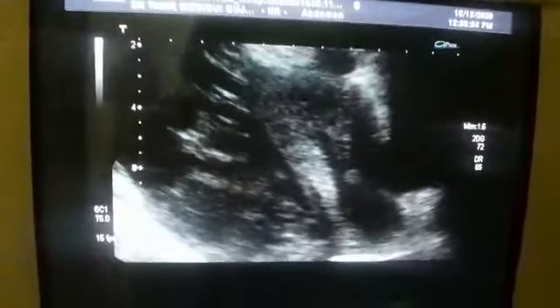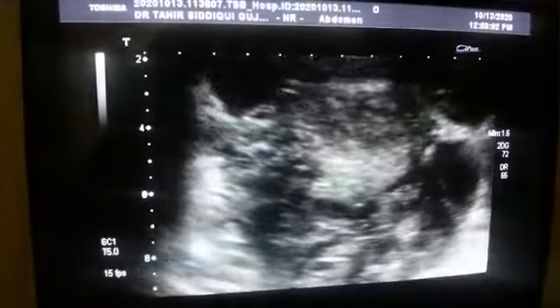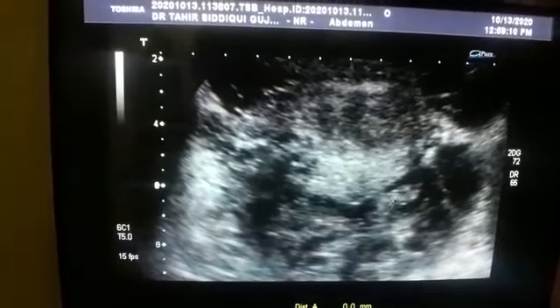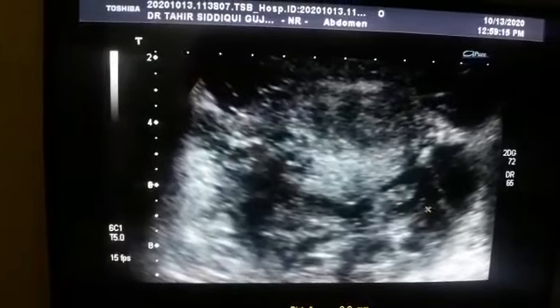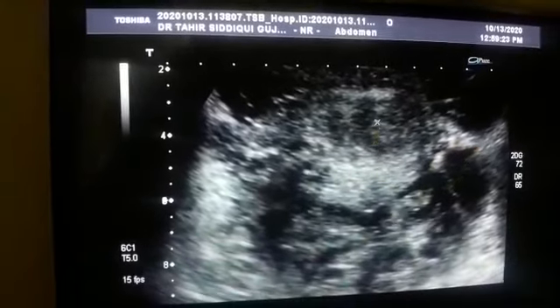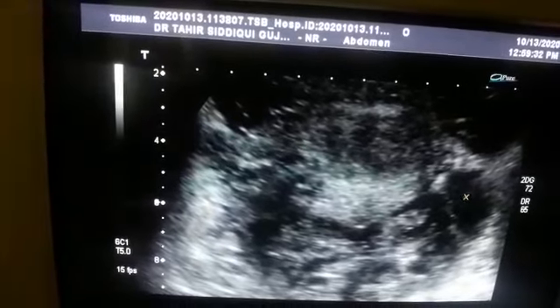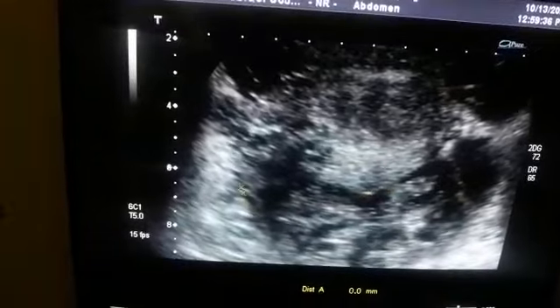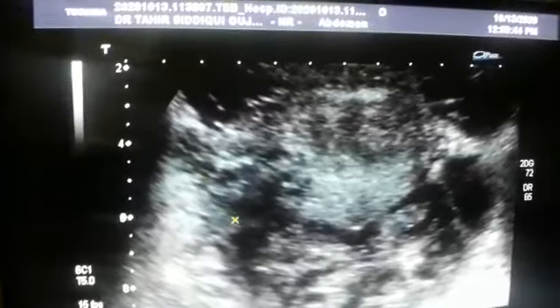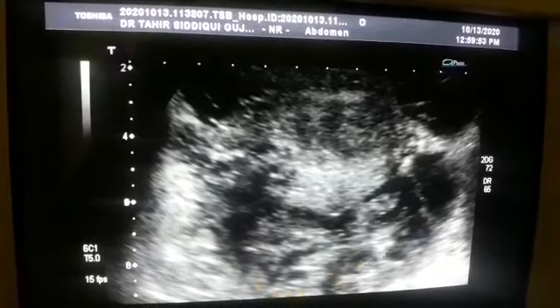And now I'm going to give a sweep to take a transverse section of this uterus. Now in transverse section, you see that there is fluid, full of internal echogenic areas with tiny punctate calcifications, and this is just below the uterus in the pelvic cavity. This is also part of it. Septas are seen. This is a septa. Now, this is also fluid. So there is a fluid collection full of tiny echogenic areas, septas, and debris of different strengths.